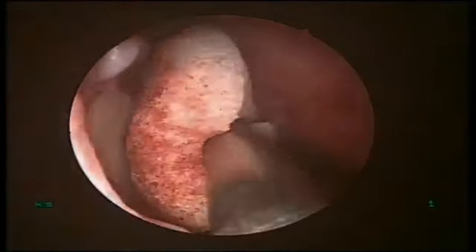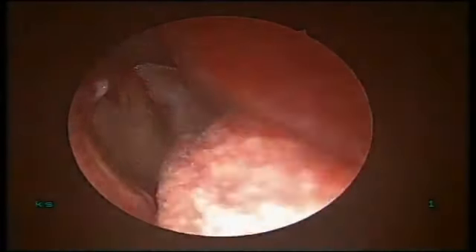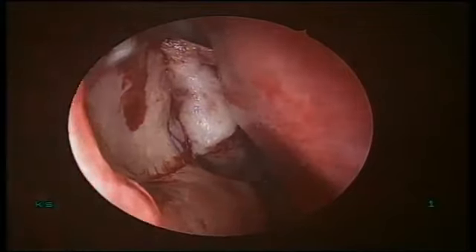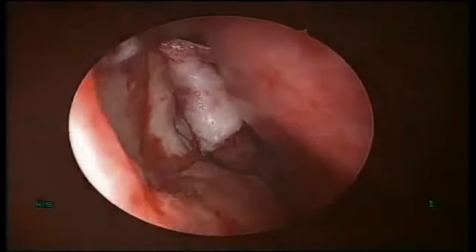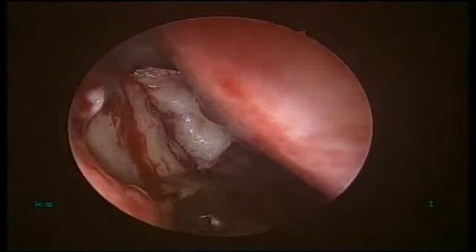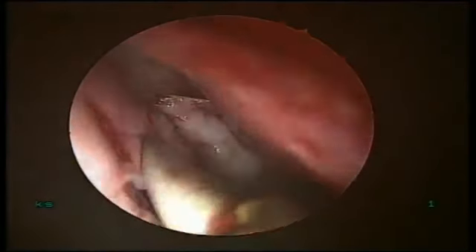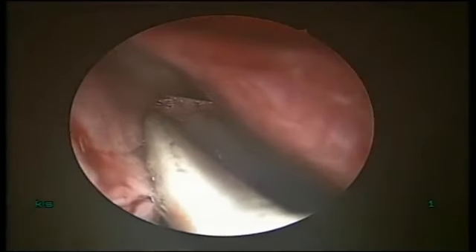You can cauterize, simple. Here you won't find any significant bleeding for that matter. Sometimes you may have oozing from the mucosal margins. Either have some patience or just apply some cautery.